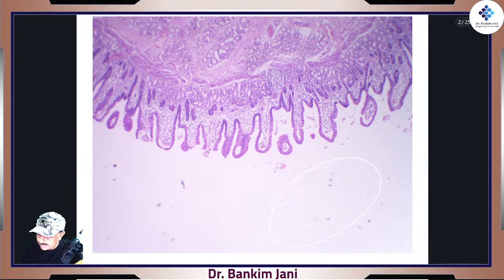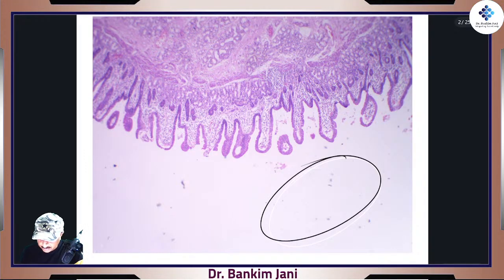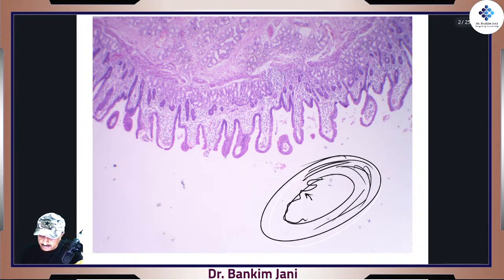So if this is the duodenum, our interest is here in the cavity, right? Because over here there'll be smooth muscles and arteries and many other structures, which we'll study as they come. But our focus right now is on the inner core, inner bore, inner wall, right?